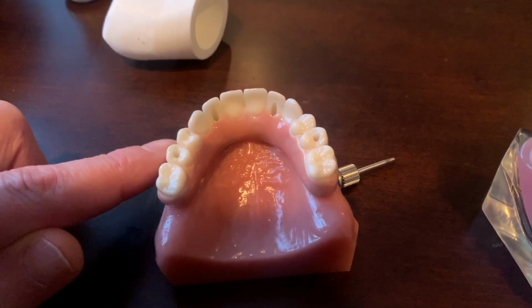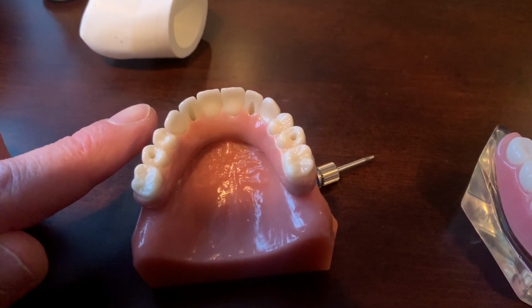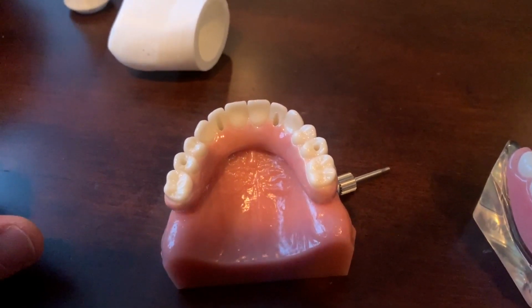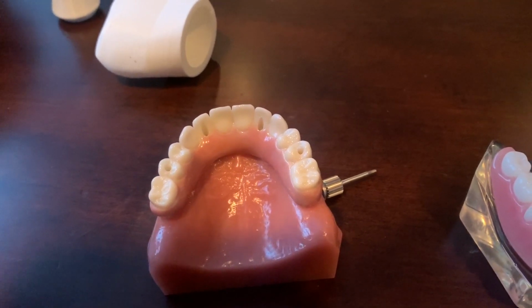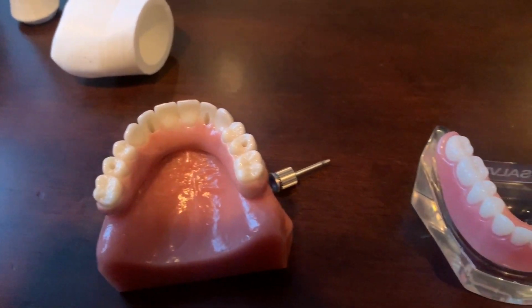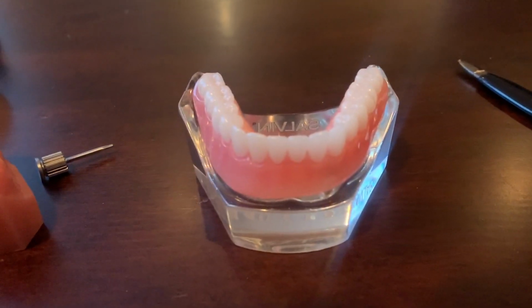Again, this bridge stays in the mouth permanently. It is not intended to ever come out. These bridges are made by 3D printers, and they are milled from a block of zirconia. They're very strong.